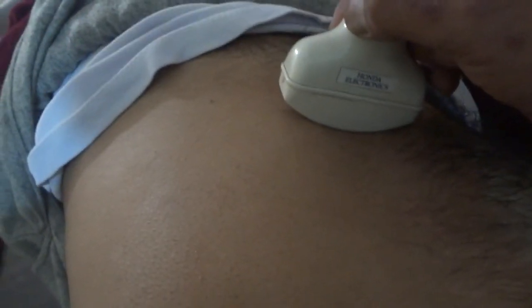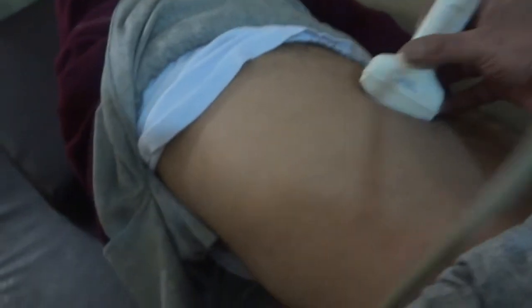It will all depend upon the patient's size. The ideal scan is that we perform on a thin patient.